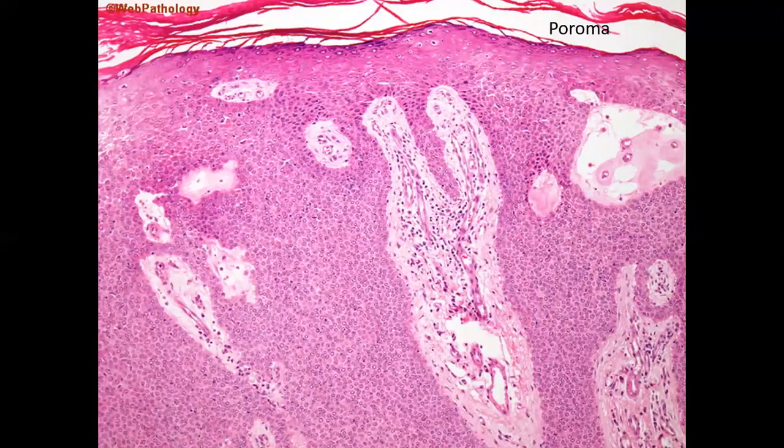I've described poroma in the portion on epidermal tumors. Poroma is characterized by its origin from the acrosyringium in the epidermis, and from there the nests are seen going deep into the dermis. So the poroma is characterized by cuboidal-looking compact cells which maintain desmosomal communication with each other and are seen well differentiated from the normal-looking keratinocytes.